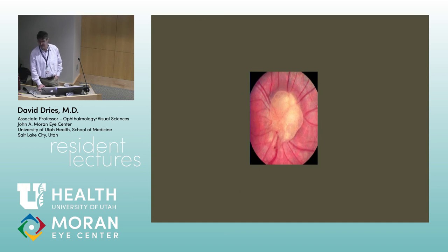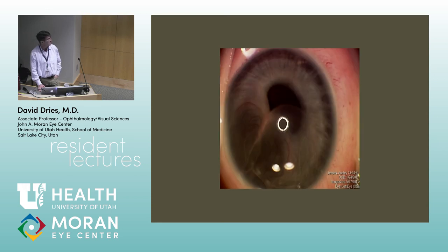This one? Yeah, there's no feeder vessels. In a tumor that size, there would be feeder vessels. This one? I didn't talk about this one. Differential. Look at the date of birth. 1/24/2011. Imaged on 5/27/2011. That's a baby. I'll just tell you, because I didn't talk about it in the lecture. It's an iris epithelial cyst.